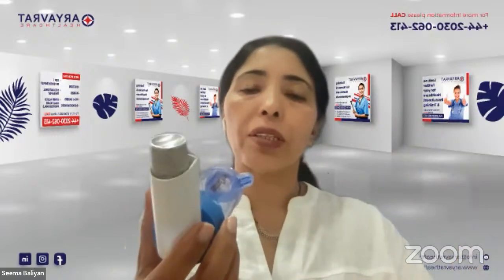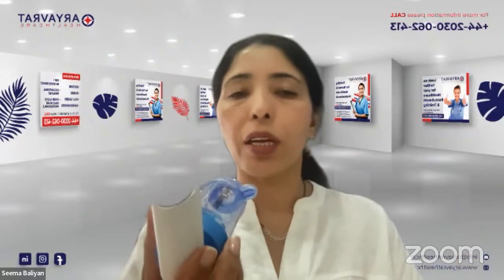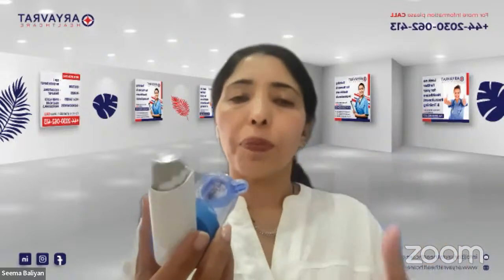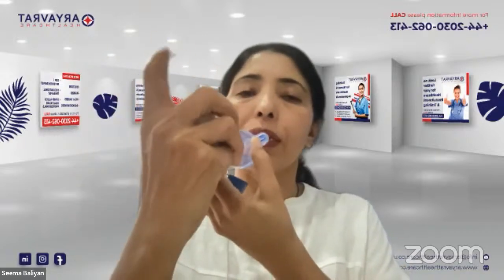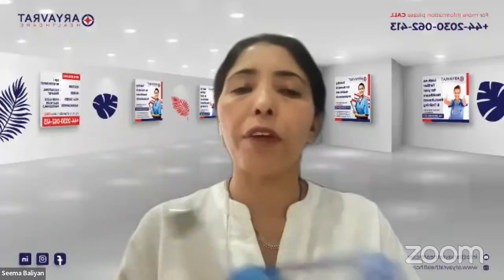You will check that the patient is still sitting in an upright position, with the neck in the neutral position. You will ask the patient to take a deep breath out and make a tight grip, and you are going to press the canister one more time, and the patient is going to take 5 more breaths.